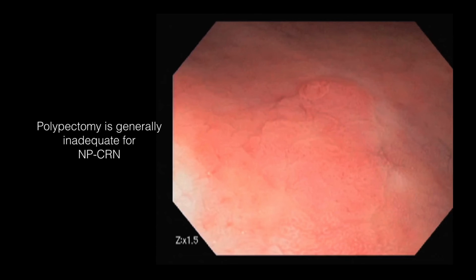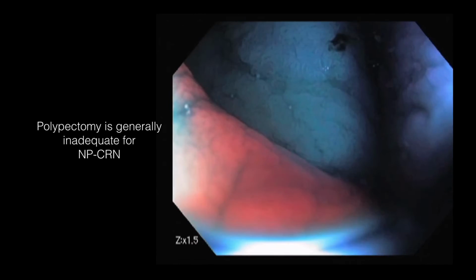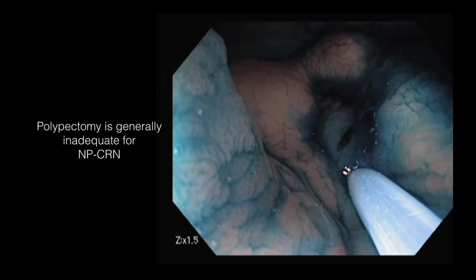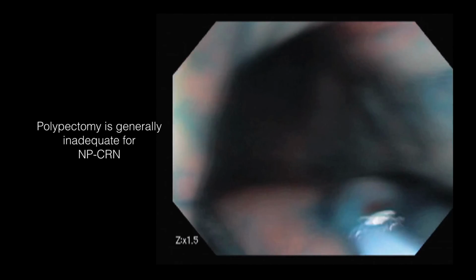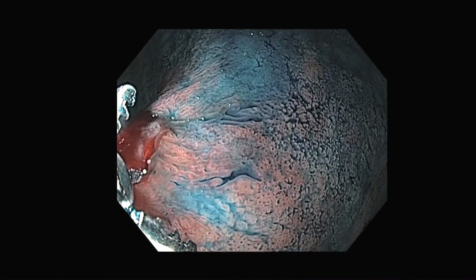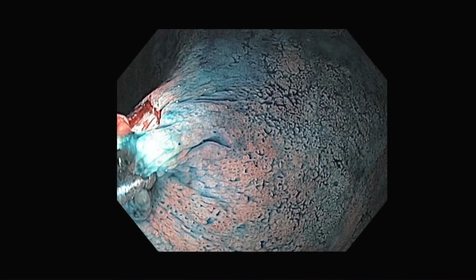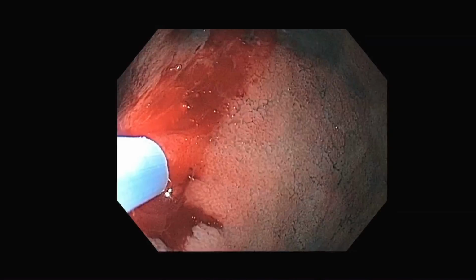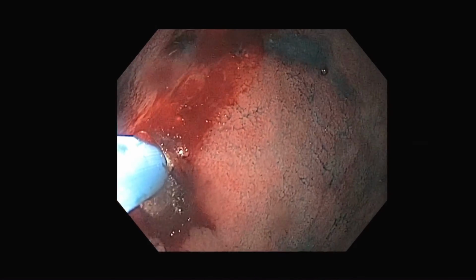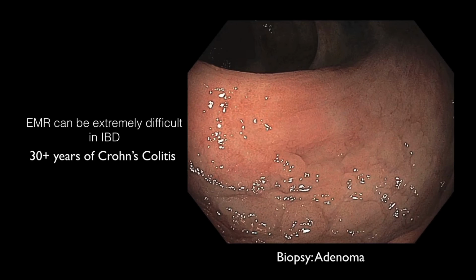This lesion was referred following repeated attempts at multiple biopsy removal. Recurrence is obvious, emphasizing the importance of proper and complete resection technique. Again, the practice of multiple biopsies with or without argon plasma coagulation is an inappropriate, ineffective treatment strategy and is strongly discouraged. Endoscopic resection in the setting of chronic inflammation can be difficult.